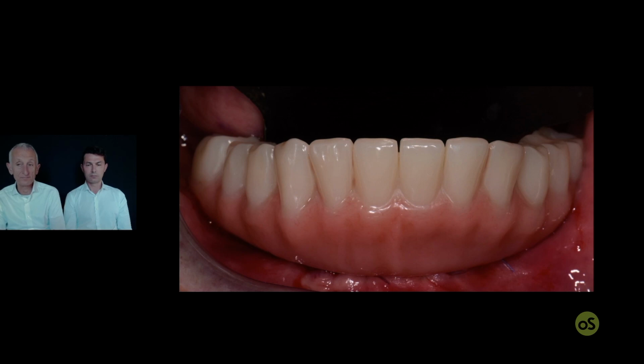And I learned this concept from my friend Dr. Lem from California, and indeed he showed me that using this kind of monolithic denture, because they are mostly two pieces, but basically they behave like one piece, you can really minimize the number of chipping, cracking, fractures that may happen with other kinds of shell in the medium or long term.